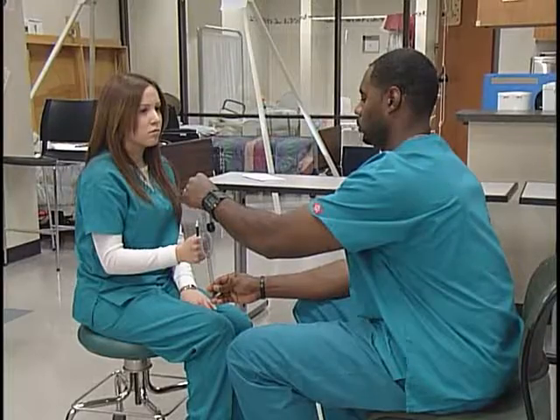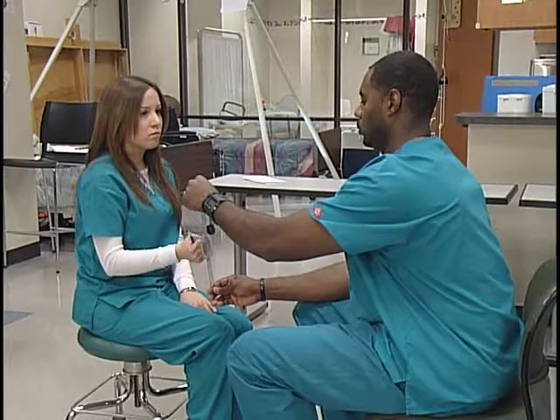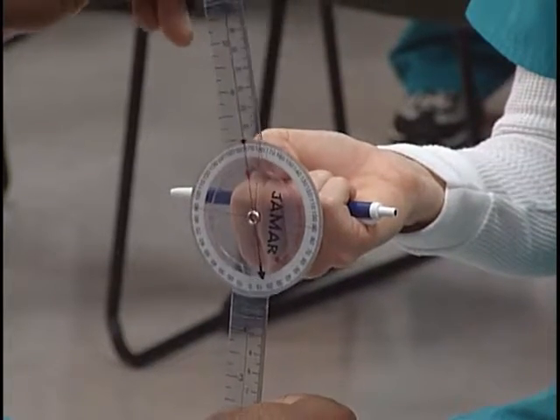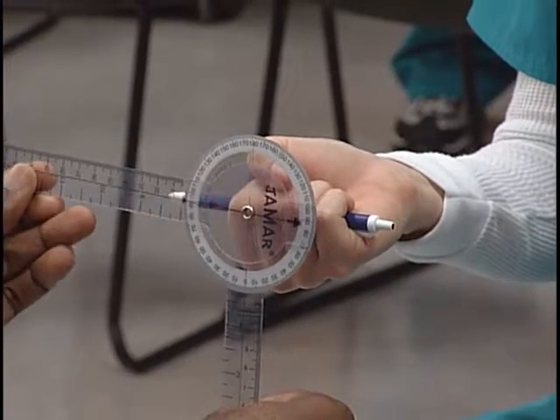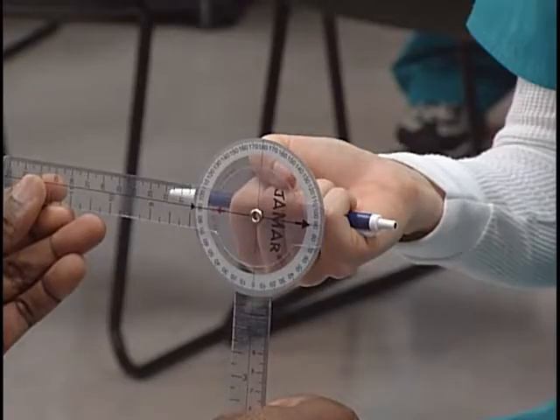The client's forearm is rotated laterally around the ulna. The measurement begins at zero degrees and can range to 80 to 90 degrees.